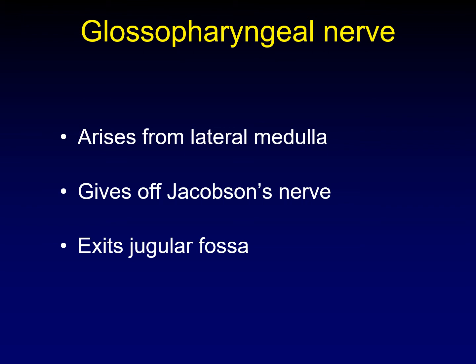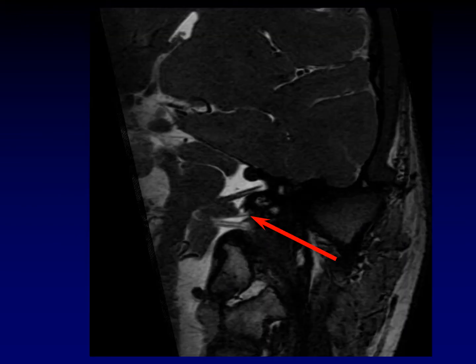Anatomically, the glossopharyngeal nerve arises from the lateral aspect of the medulla. It gives off Jacobson's nerve that runs through the tympanic cavity and has some important pathologic implications. After traversing the lateral medullary cistern, the glossopharyngeal nerve exits through the jugular fossa, specifically the pars nervosa. On this oblique steady state free precession sequence, you can see the glossopharyngeal nerve traversing the lateral medullary cistern, just above the duplicated vagus nerve.